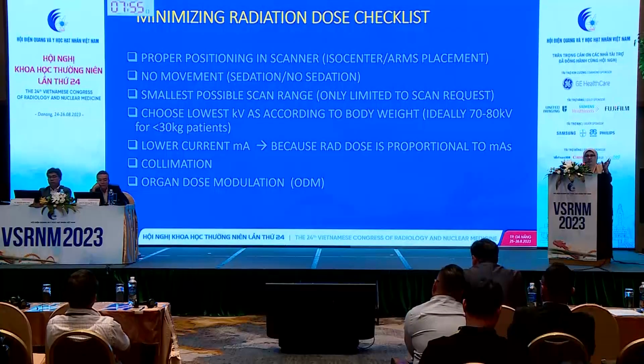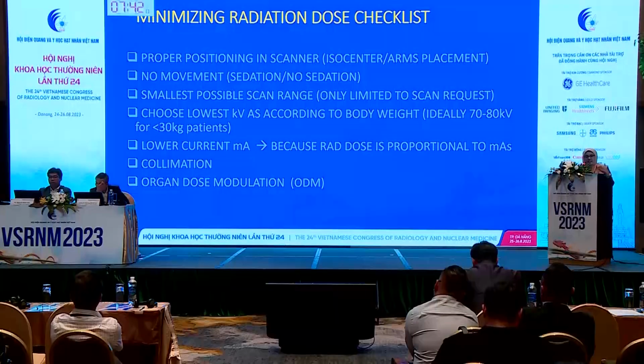Always remember, you should put the patient in proper positioning inside your scanner, preferably with no movement. Of course, if they are very small babies, efforts need to be made for sedation. Use the smallest possible scan range depending on what kind of scan is requested. And like I mentioned, the selection of kV, and also collimation and organ dose modulation.